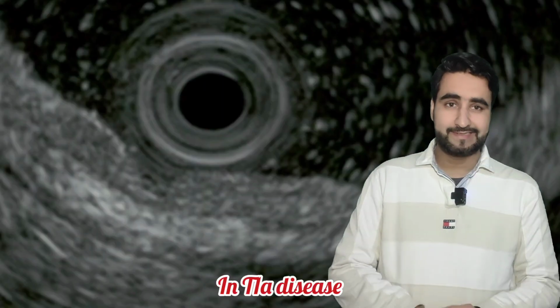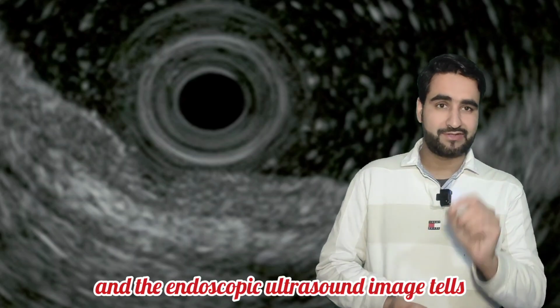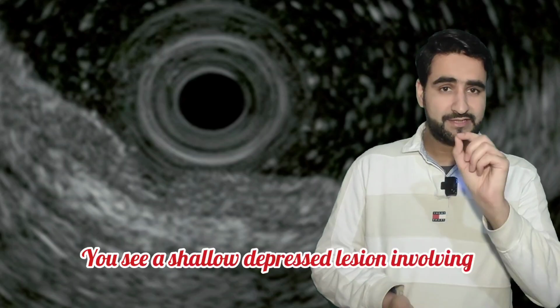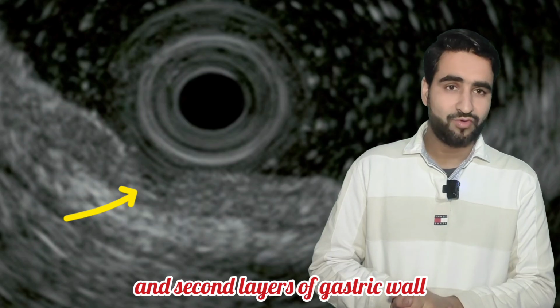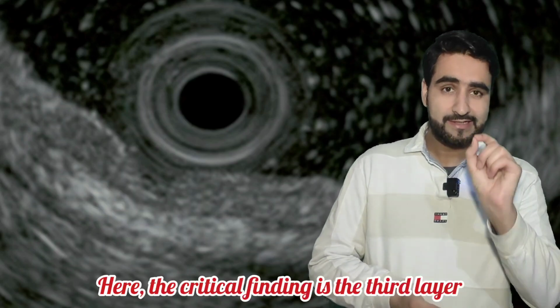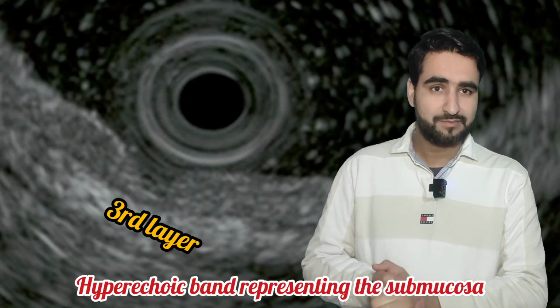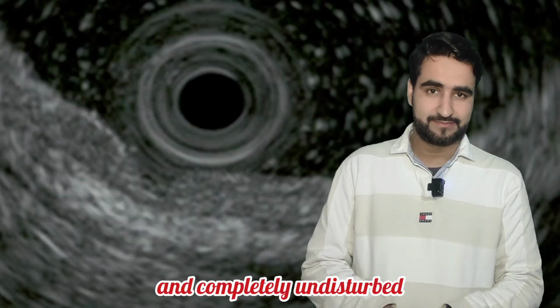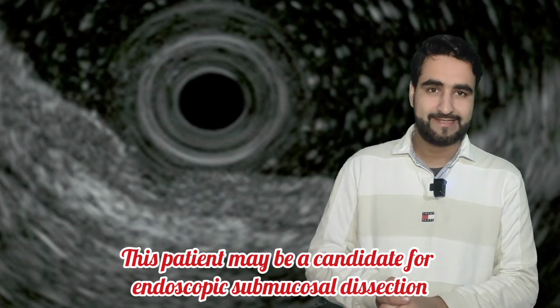In T1A disease, the cancer hasn't yet broken through the mucosal layer, and the endoscopic ultrasound image tells us this with a specific recognizable pattern. You see a shallow depressed lesion involving only the first and second layers of the gastric wall. The inner mucosa shows irregular thickening. Here, the critical finding is the third layer, the hyperechoic band representing the submucosa. It remains smooth, intact, and completely undisturbed. This patient may be a candidate for endoscopic submucosal dissection.